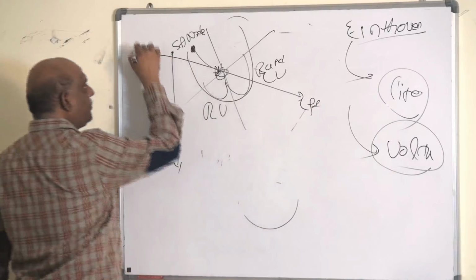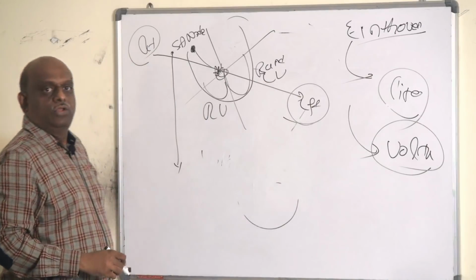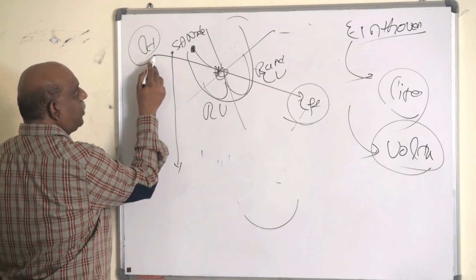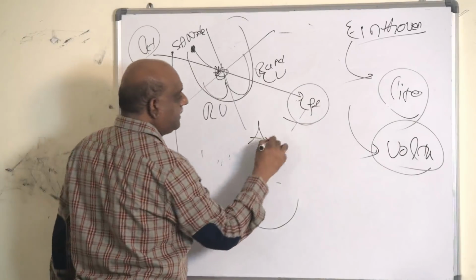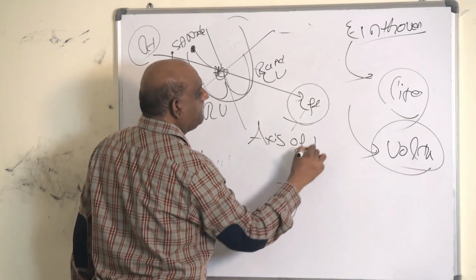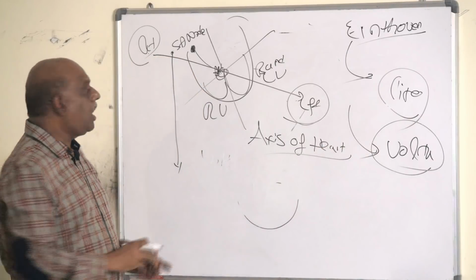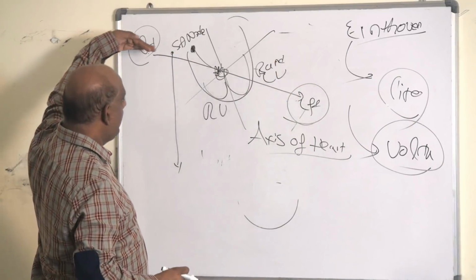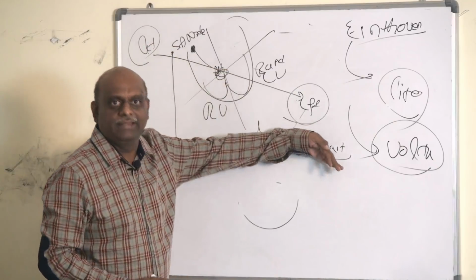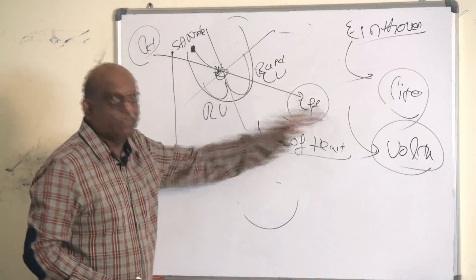From the right towards left. This, above to below and right towards left, is called the axis of the heart. So how will you be able to realize whether this electrical depolarization is passing above to below, from the right towards left?